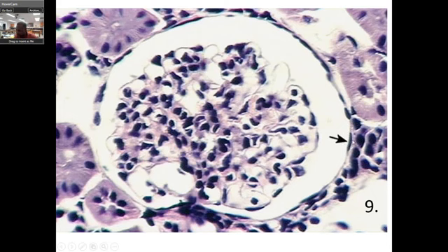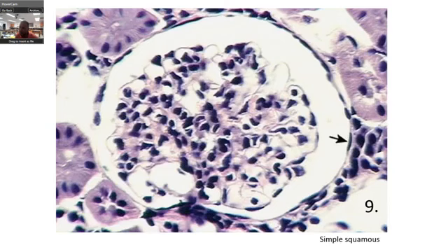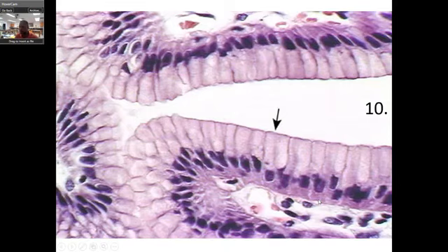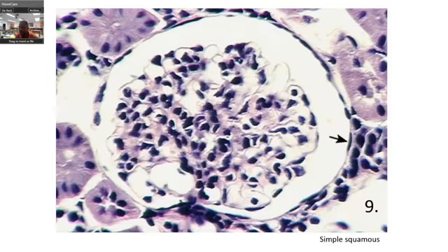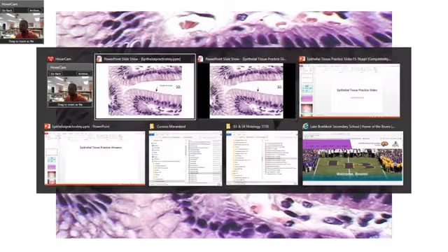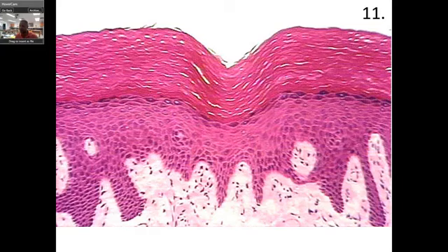Now, make a note. See this flat cell? Flat, going all the way around? This is a lining. One of the properties of epithelia is to work as a liner. So that's simple. This is a flat, simple squamous cell. All right? Now take a look at this. See the nuclei, they're uniform. You don't see any cilia coming out of this. So what do you think it is? Gotta go back to the next one, and that is simple columnar. That was simple columnar.